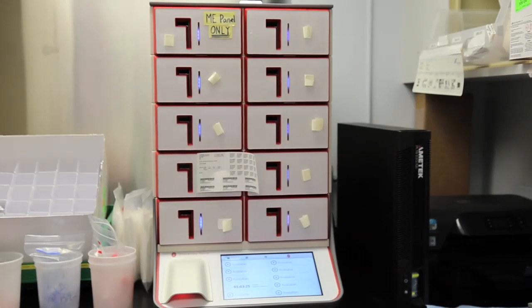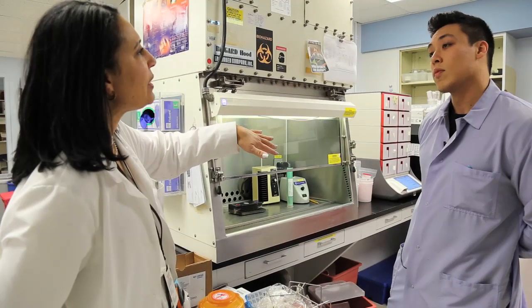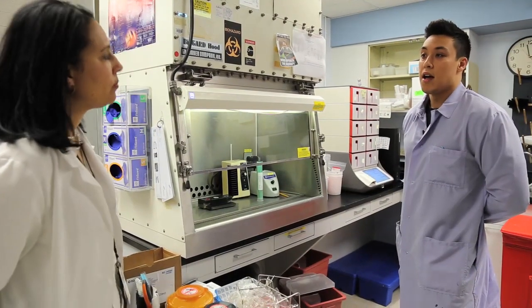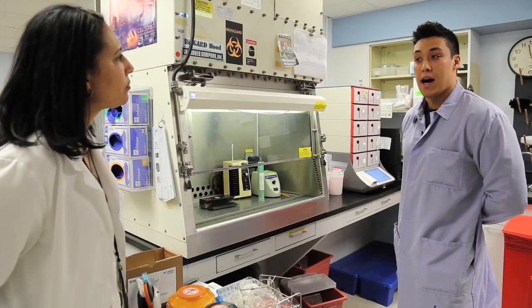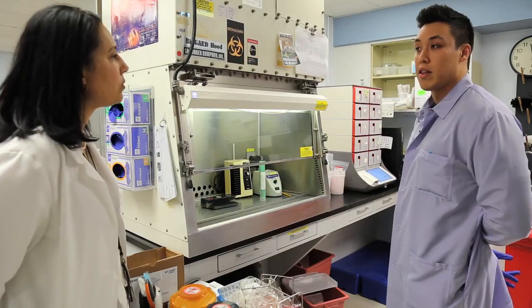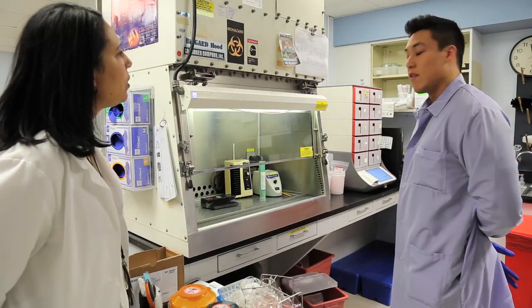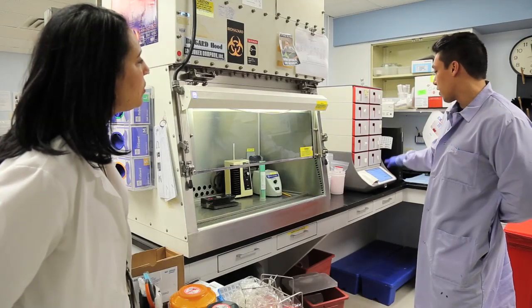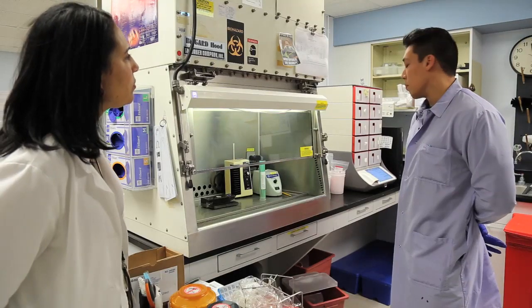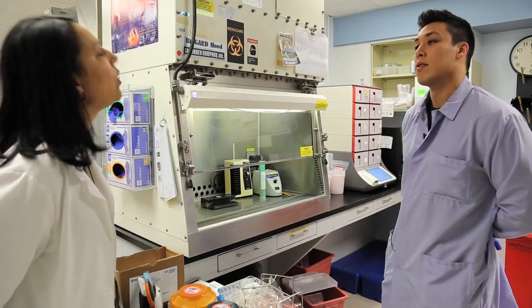I wanted to ask you, with this BioFire, can you run any of the several different types of specimens at the same time, on this machine? Sure, yes. Each slot can run any of the assays. The assays are specific to the barcode on the pouch, so it can read which assay we want when we scan our specimen prepared in the pouch. However, we do divide up each slot for specific assays if possible. For example, there are some slots that are specifically designated for the stool PCR panels only, some for the meningitis panel only. This is to minimize any risk of contamination and also to assure that each assay has a slot and can be run.